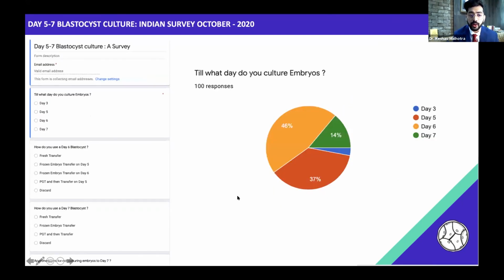Out of almost 100 responses, we found out that 46% of them were culturing only till day 6, 37% of them were culturing till day 5, and day 7, if you look at the results, only 14% of the embryologists actually cultured till day 7.